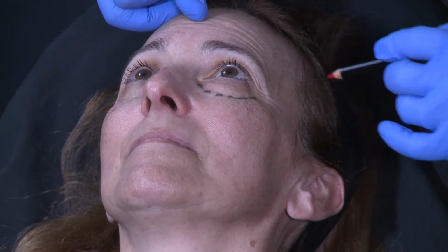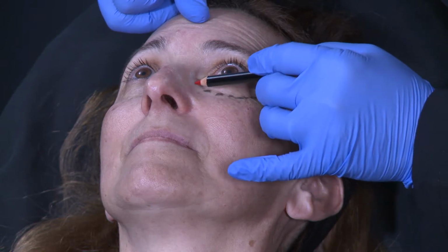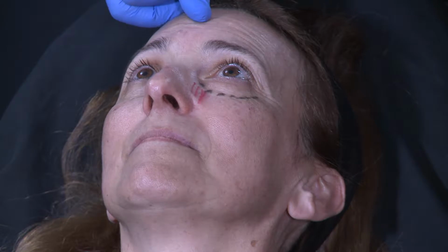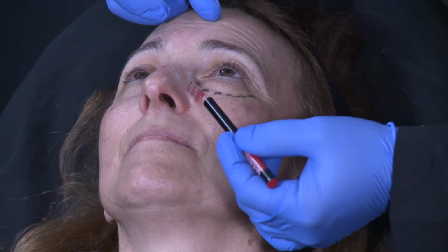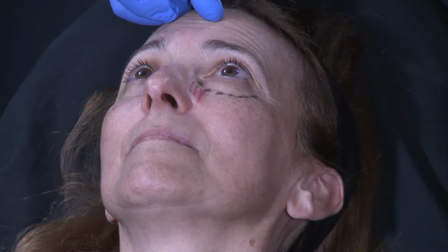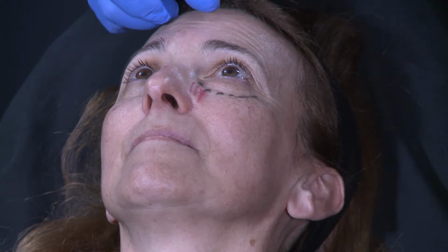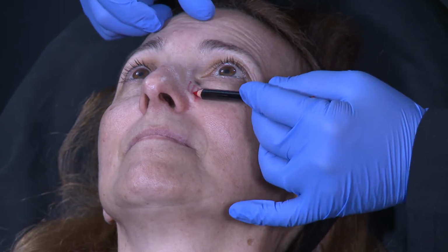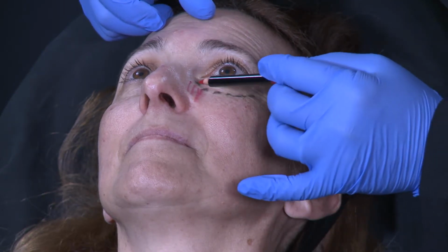And you will see with the video of this afternoon that in this area here, this is where your facial artery is running. And this facial artery is running above the muscle. So it means that if I have to choose one plane to inject, I will inject in this area here, very deep, just to avoid the danger here.